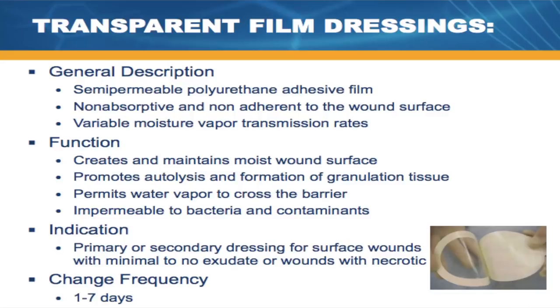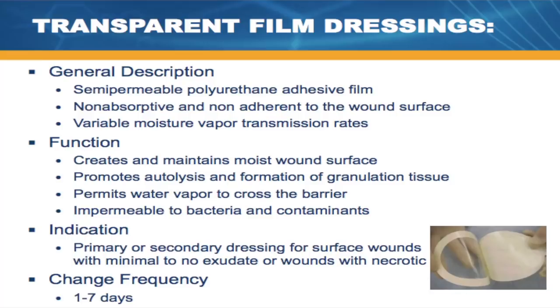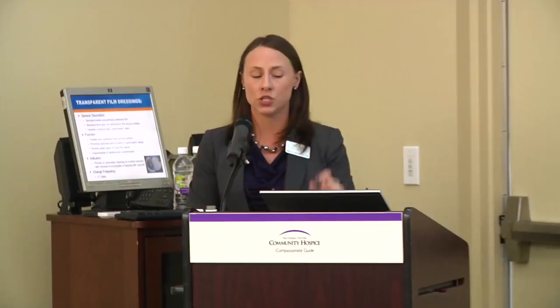These dressings do not have the ability to absorb any fluid. So if it is a wound that's draining anything more than scant amounts of fluid, you really would need to use this in combination with something else. But they work really nicely to hold on other types of dressings. You might be using them even to patch a type of dressing if a corner has become dislodged or if you just need a bit more adhesive in a very tricky area.